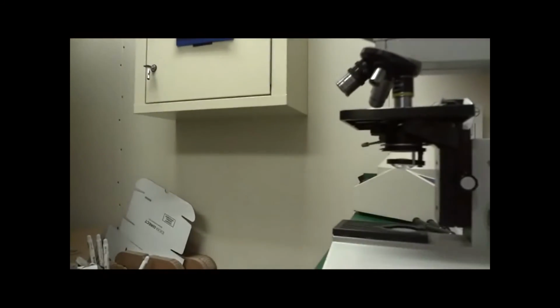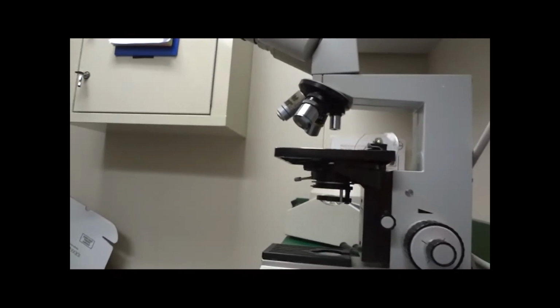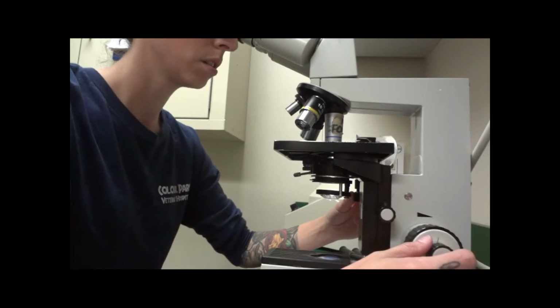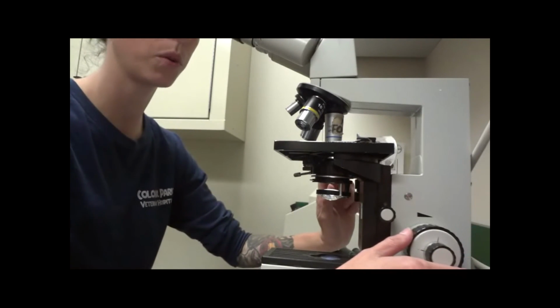Alright, here we've got our microscope and our microscope slides. We're going to examine this under the microscope at low power. Alright, I am seeing some incompatibility here, if I'm reading this correctly. Some agglutination perhaps. Which we could kind of tell based on physical appearance, some hemolysis was present. And that's how we perform a cross match.